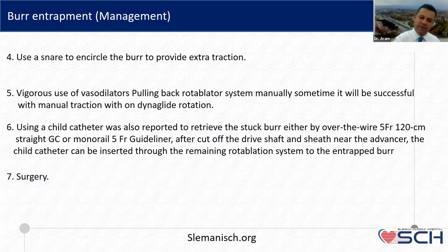We can deliver a 5 French guide catheter inside to be as close as we can to the stuck burr, and we try to pull the shaft inside the catheter and pull all the system together. And the final option is surgery. I think that in the vast majority of cases, if we cannot pull out the system altogether simply, the solution is surgery. That's why it's better to do rotational atherectomy in a center in which surgery is available.